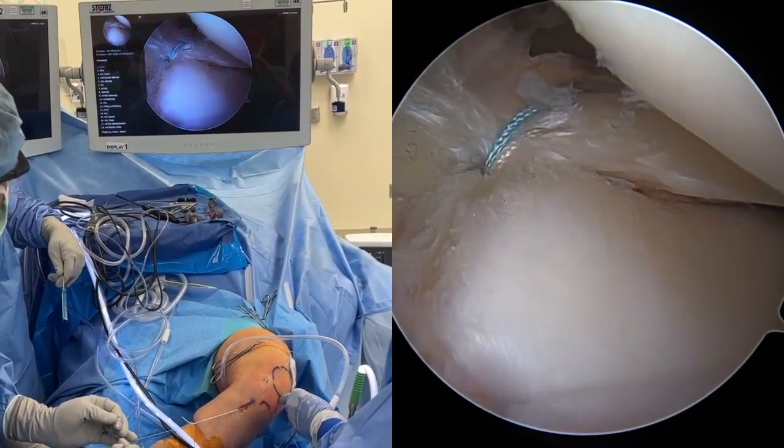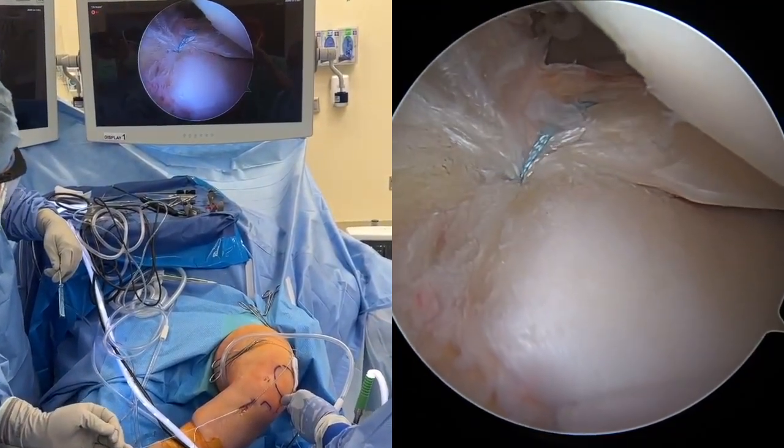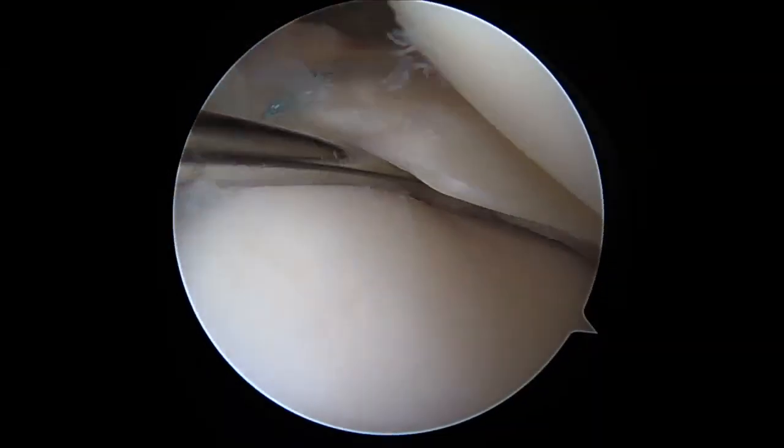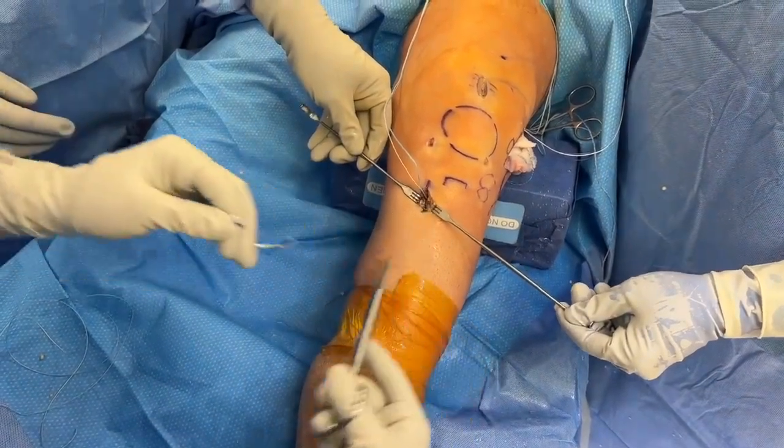The suture lock implant repair sutures are differentially re-tensioned down to the anchor. A probe is used to confirm appropriate tension under direct visualization. Once a robust repair is achieved, the implant suture limbs are cut flush at the anterior tibial aperture.